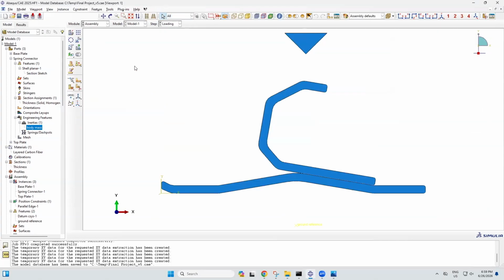Next is the assembly, where I created 3 instances of the spring connector, the top plate, and the base plate. I also created a reference point down below. In the assembly, I translated and rotated the top part to line up with this base plate right here and this line here, where in the prosthetic, the top plate would be screwed into or bolted to the base plate. Additionally, I translated the spring connector to be 2.6 centimeters above the top plate, which is the length of the spring that we are going to be using.